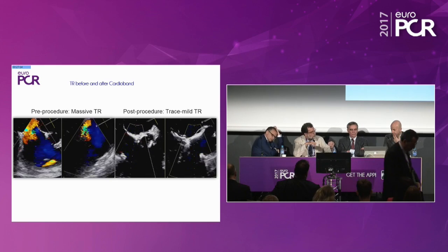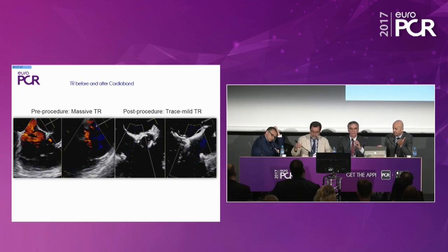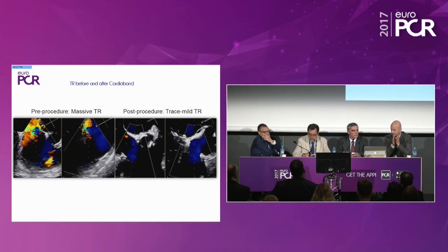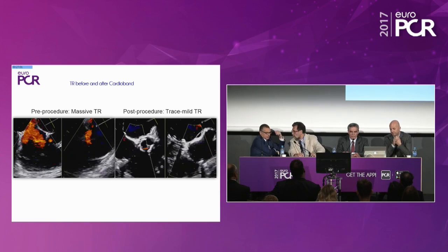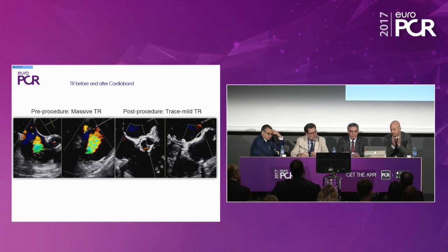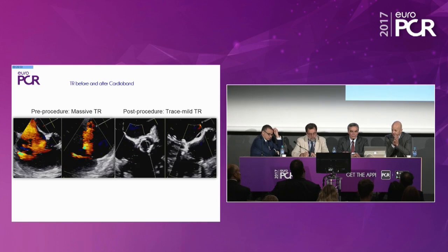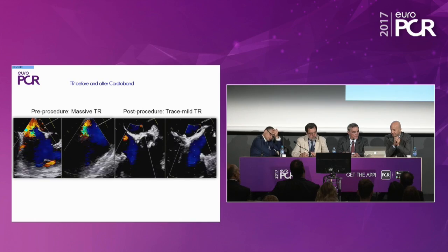doesn't lead to poor outcomes. Can you just explain? Yeah, I mean, Karl-Heinz just showed us the safety data. We had 2 patients in which we had bad experience up front, very early experience in 2 patients. And ever since then we didn't have a real safety issue so far. So to this question, I think it is as safe as it is on the left side.